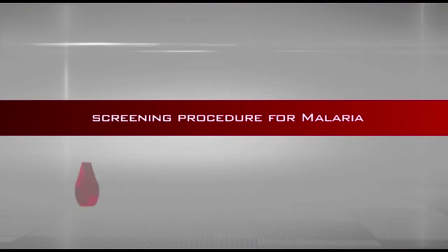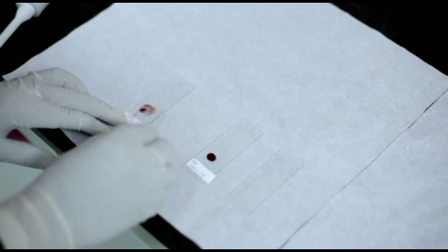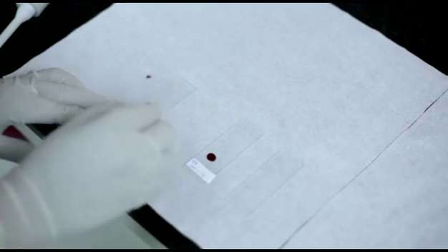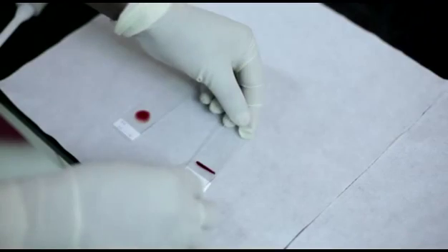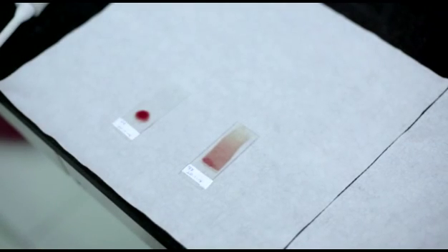Now let us move on to the screening procedure for malaria. It is done by the microscopic examination of thick and thin blood smears. Prepare at least 2 thick smears and 2 thin smears from the EDTA sample within 2 hours of collection. Stain only 1 set of smears and leave the duplicates fixed in methanol for restaining when in doubt.